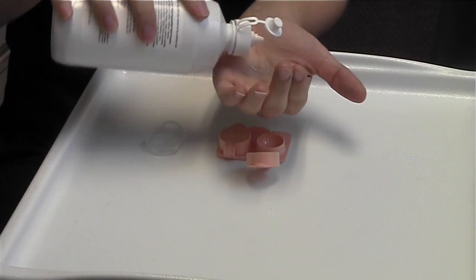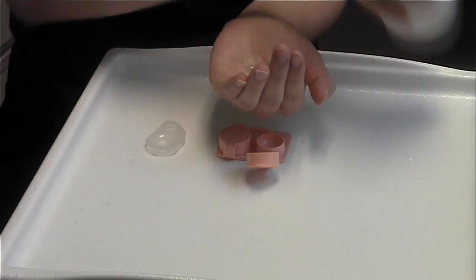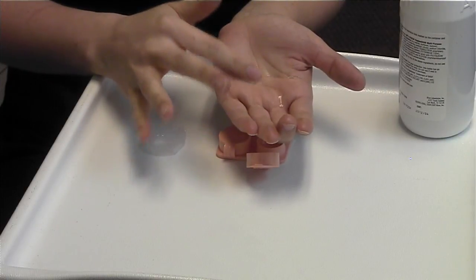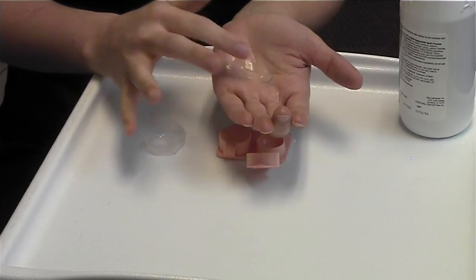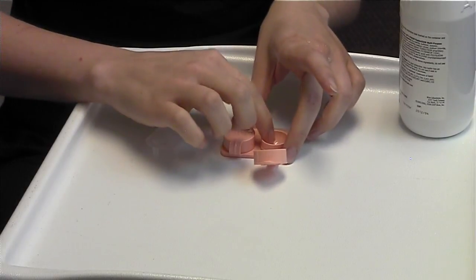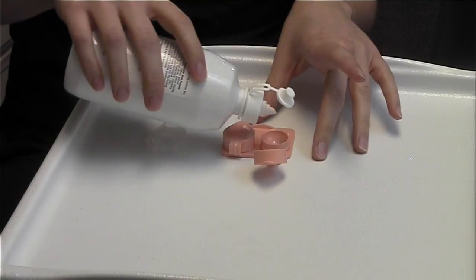Take a few drops of your multi-purpose solution and rub it with your forefinger. That'll remove any deposits and debris from the lens, and then you'll put it into your case and cover it with some more fresh solution.